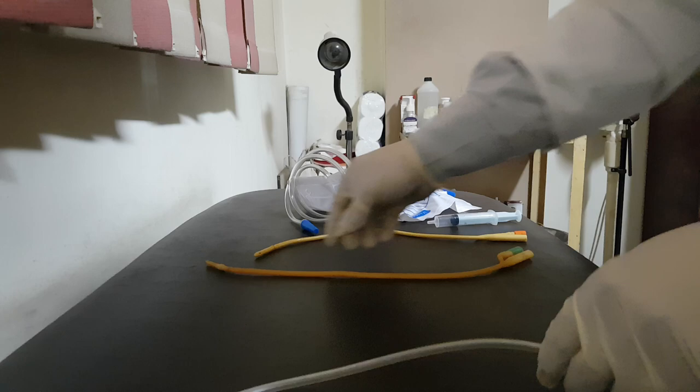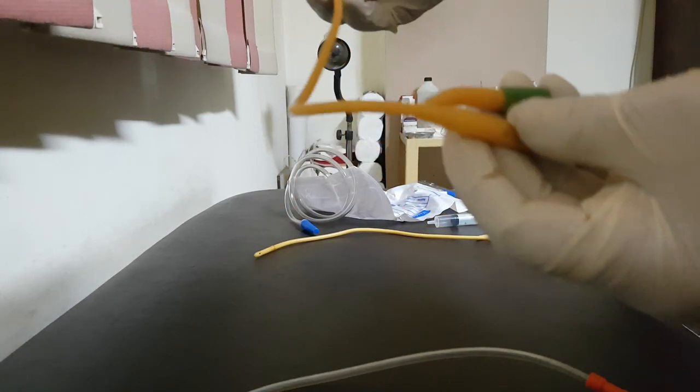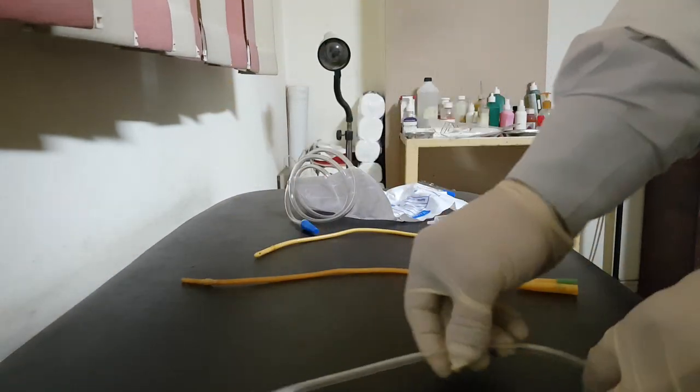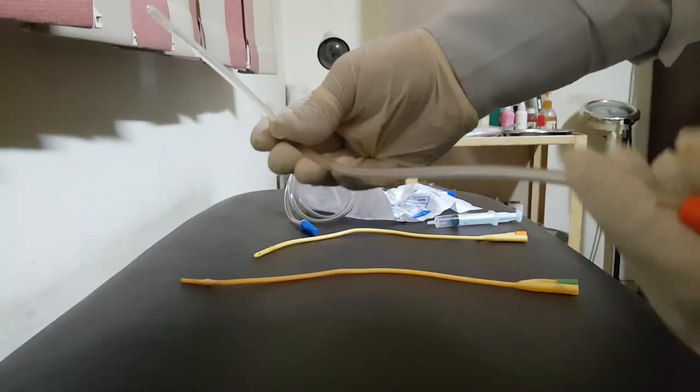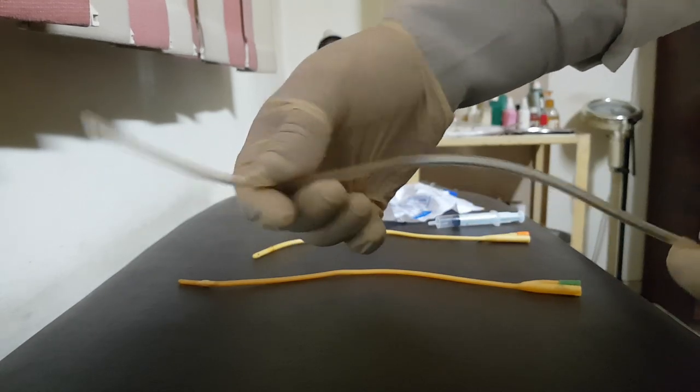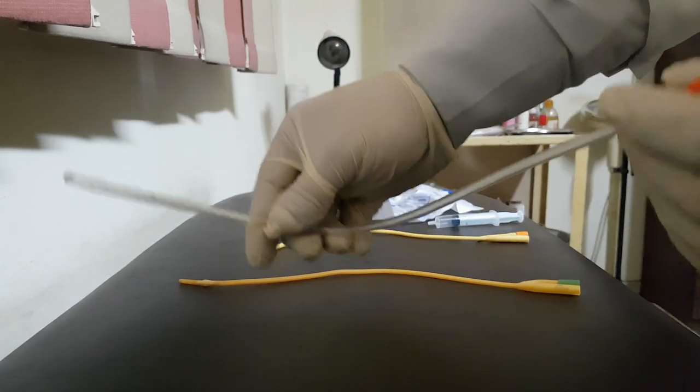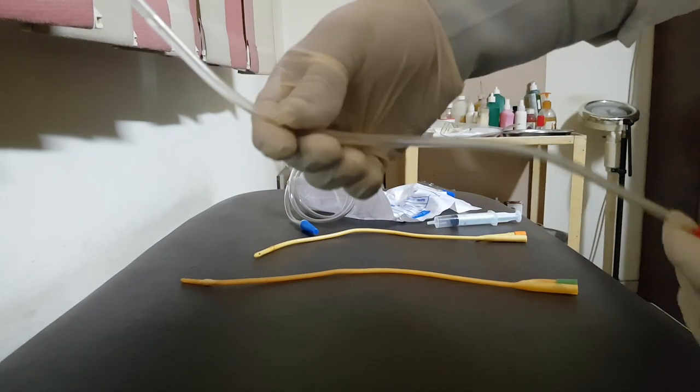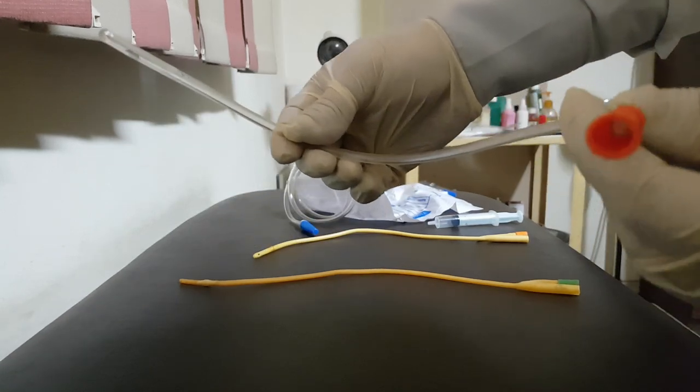Another example of indwelling catheter is Foley catheter, this one, of different sizes of course. The use of intermittent catheter is to evacuate the bladder, can be used by the healthcare provider and also the patient, if trained, can do it at home. So the aim of Nelaton catheter is to evacuate the bladder in case of retention of urine.